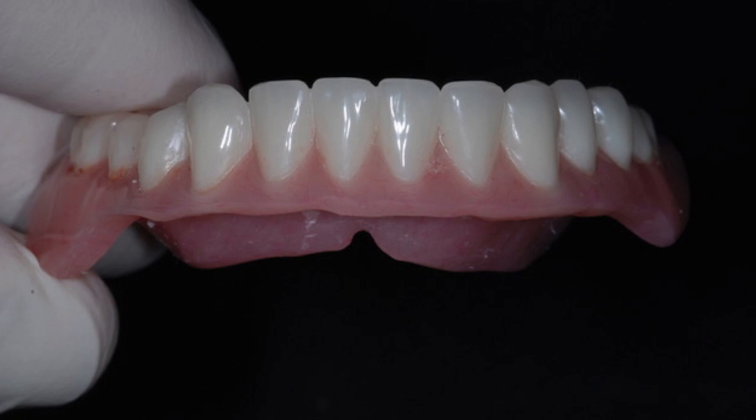Now, another quick thing that we've picked up with this system: I had the lab person doing several cases, and I figured out another little pearl here, which is to take some of that facial flange away. So you can really see where this lines up, because once you do the initial pickup, you've got the low retentive, almost like a lab housing, in. Right, that processing ball, the black one. Exactly. To see this and visualize it makes a big difference.